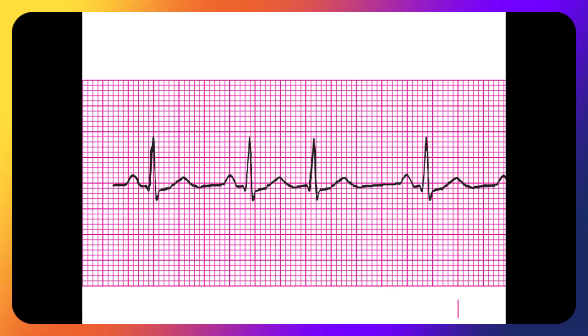Now, look at your QRS. What do you find interesting about that QRS? It's almost identical to the other ones, which means, coming back to your statement a while ago, it's following the normal conduction pathway. It's following the exact same conduction pathway as these up in here, where we have very obvious atrial depolarization.